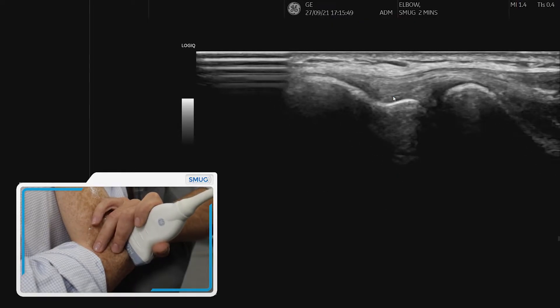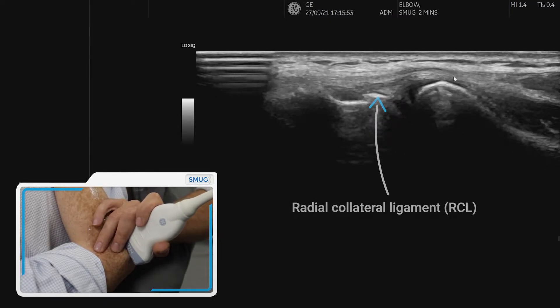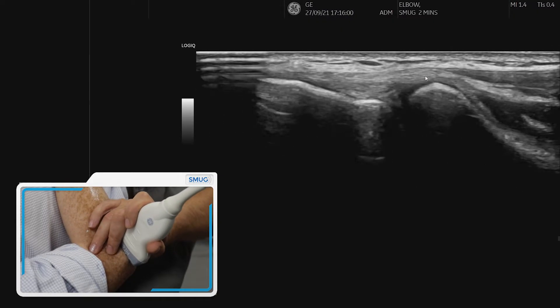And then underneath that we have the radial collateral ligament that joins up with the annular ligament that sits on top of the radial head. Now we want to assess the ECRB specifically.